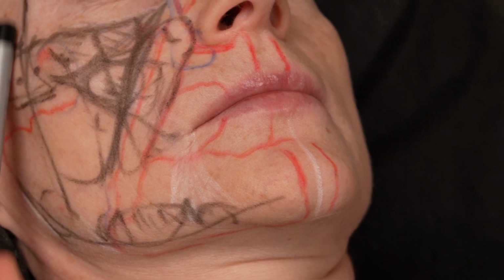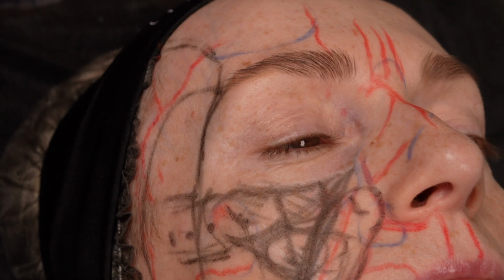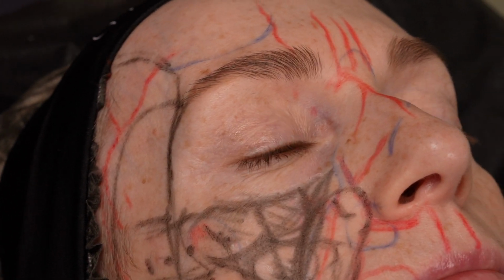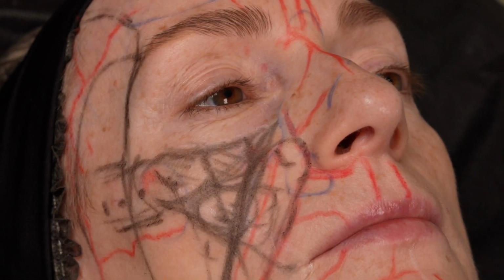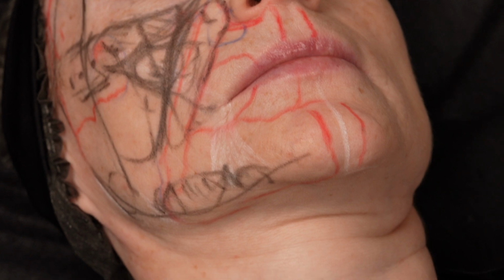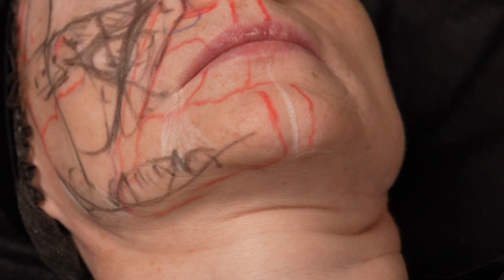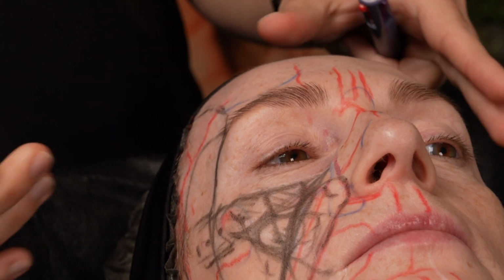From here also I find it sometimes, but it's not easy to find. How do I understand? Usually in the interfascial layer, your cannula slides more easily. That's why I think I'm in the interfascial layer, but it's hard to find from here. I think it's easy to explain from here.